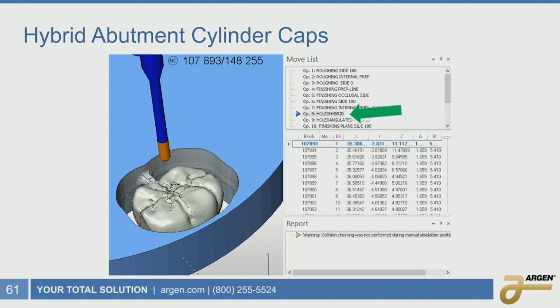A lot of customers will notice that they'll see the tool coming down and then bounce back up and then go back down and bounce back up. And what that's doing is actually removing the debris from that screw channel. If we didn't have the red caps there, the 1mm tool would just be driving all the way down.